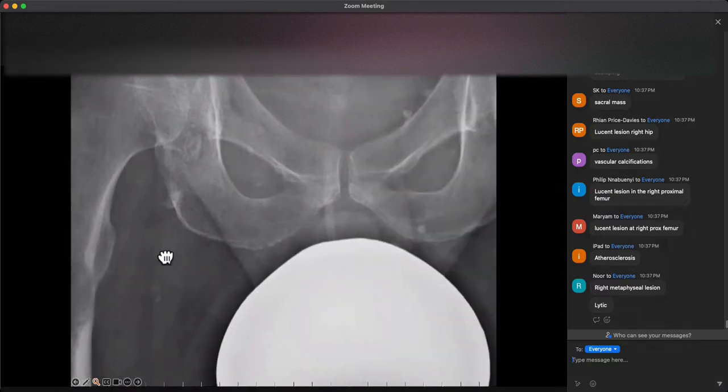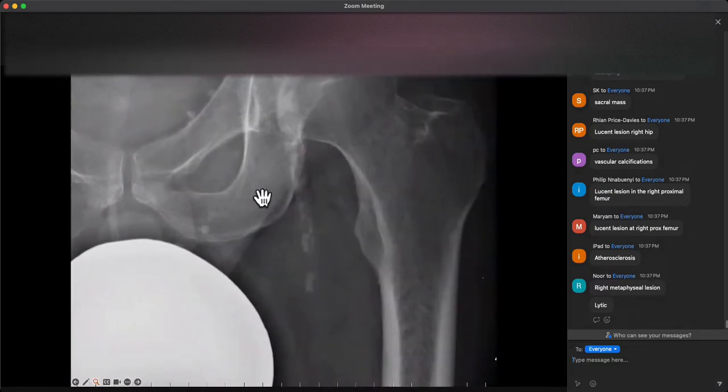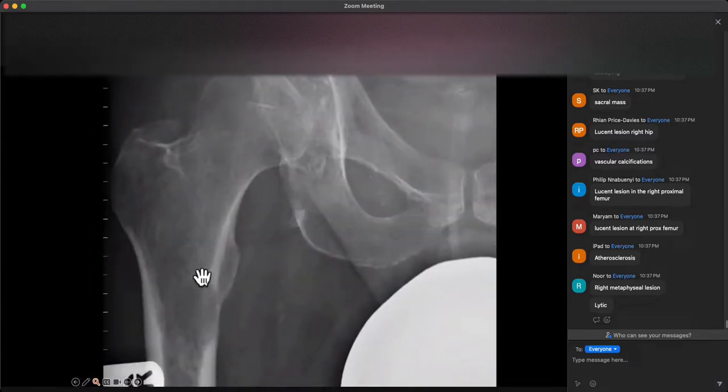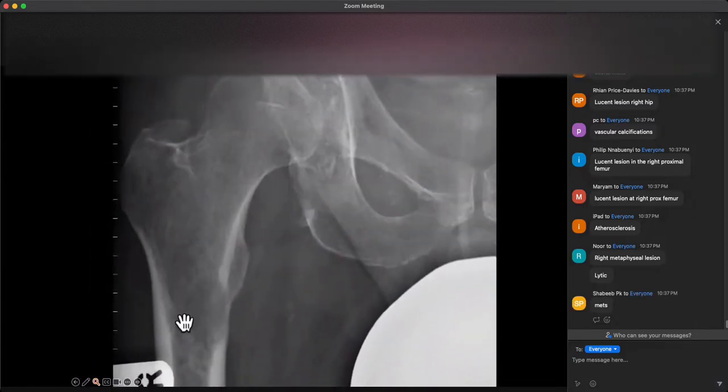And if we look at it to the other side, there's a nice cortical outline here and a nice cortical outline here. And so this is a definite malignant bony lesion, likely to be secondary to a carcinoma from breast, bronchus, thyroid, or kidney. And they're the first diagnoses that you need to come out with in the exam.